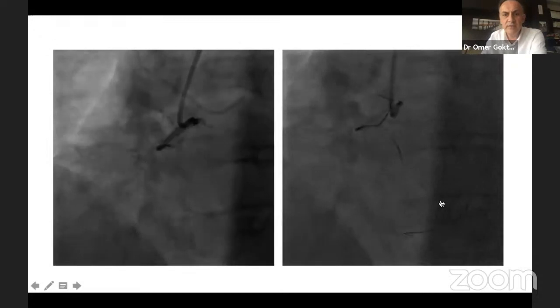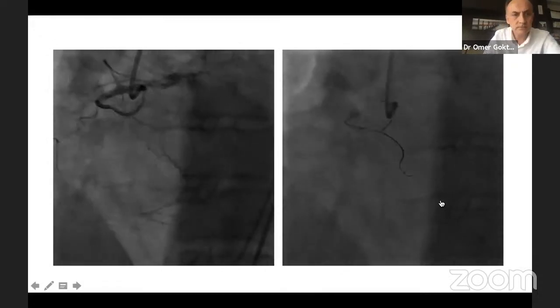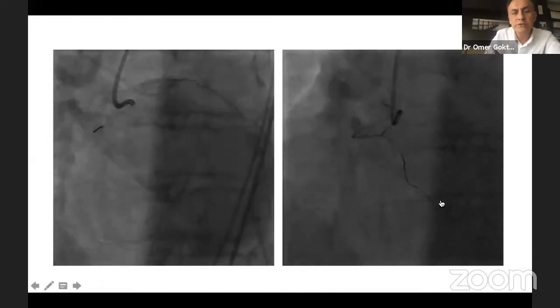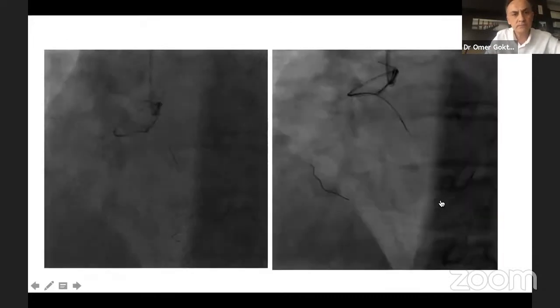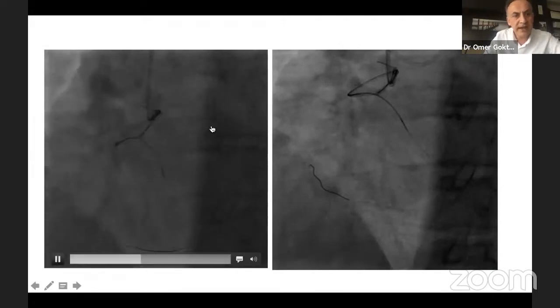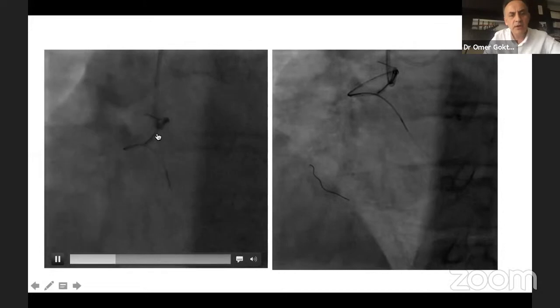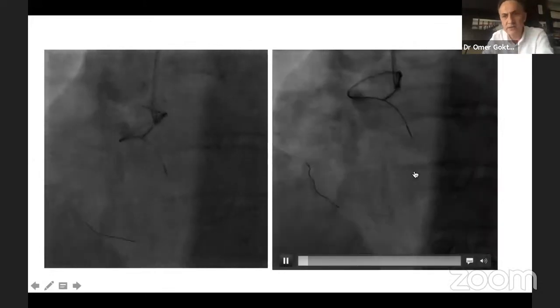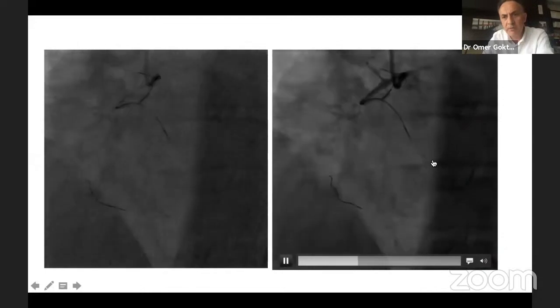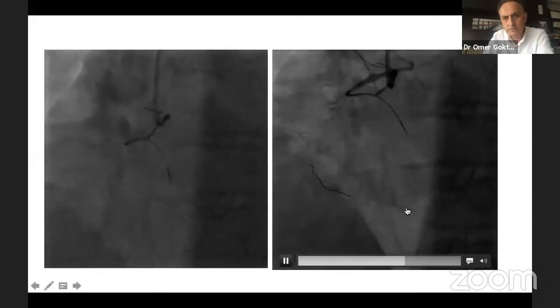and it's easily bent. You see how easy that is? Sometimes a collateral looks difficult, but when you wire it, the wire goes easily. And of course, we have to insert the microcatheter. To do that, I had to have, again, an anchoring balloon. Yes, because I have only this branch to work with, and I sent a small balloon here. It's a 1.2 balloon. It's a small branch, but I had to do it. Otherwise, it's not easy to push my microcatheter distally.